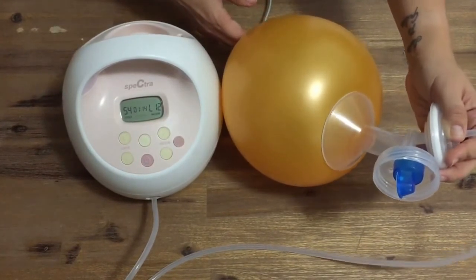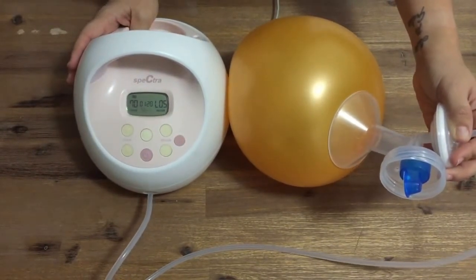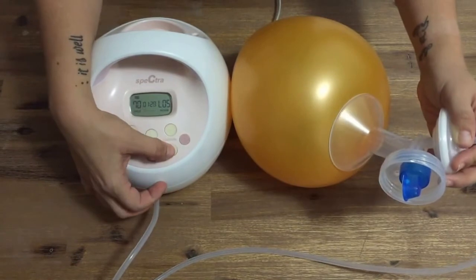When switched into let down mode by pressing the wavy button, I cannot change the cycle speed from 70 but I can change the suction strength between levels 1 and 5.